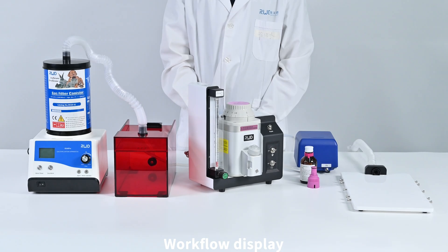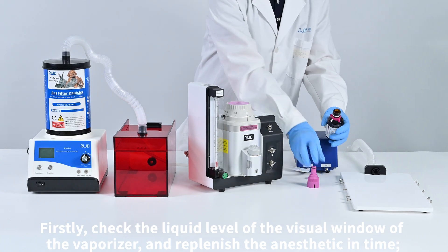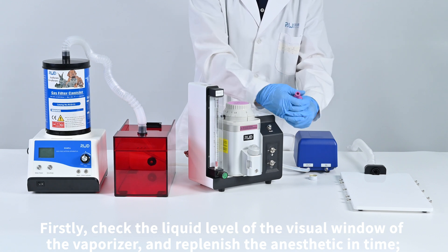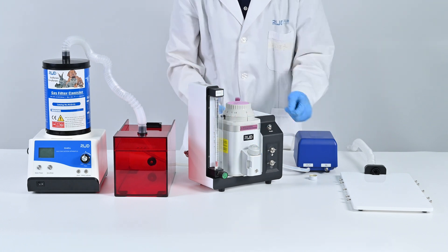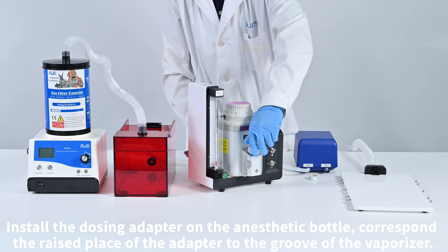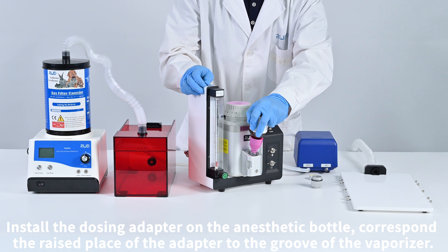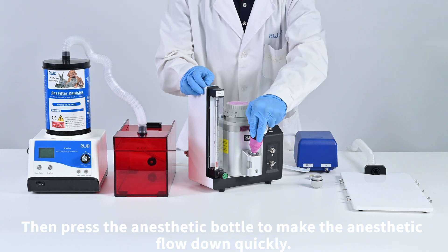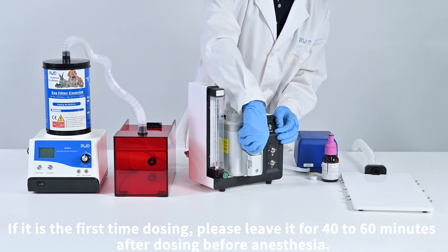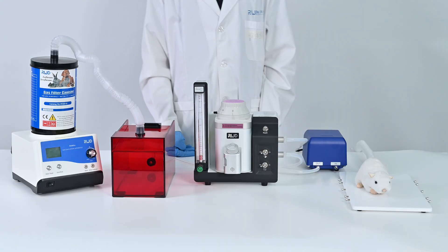Workflow display. First, check the liquid level of the visual window of the vaporizer and replenish the anesthetic in time. Install the dosing adapter on the anesthetic bottle, aligning the raised part of the adapter to the groove of the vaporizer, then press the anesthetic bottle to make the anesthetic flow down quickly. If it is the first time filling, please wait 40 to 60 minutes after filling before beginning anesthesia.